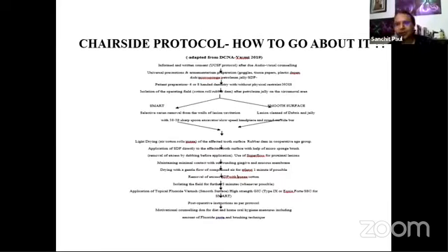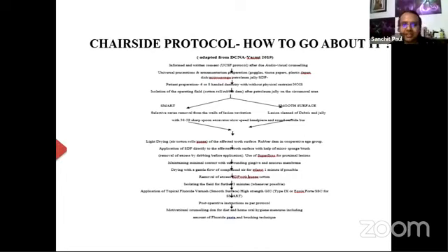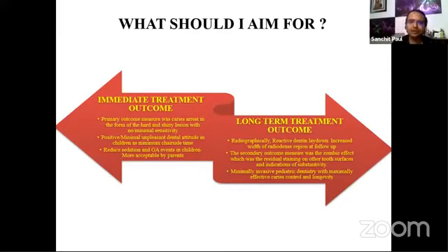So there's a proper protocol. Again, we would suggest you go to the literature. There is a beautiful article by Dr. Yasmin Crystal in DCNA 2019, which highlights everything. We are also trying to publish our own literature on this, which will be out soon, in which we highlight where to use it as a smart technique or SDF modified ART. We all know atraumatic restorative treatment, but in today's time, it's basically a smart material, SDF modified atraumatic restorative treatment, or we can use it on a smooth surface. So again, we would like to showcase more cases about how to go for it.